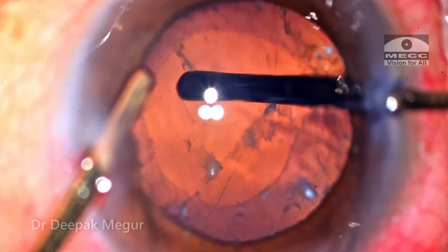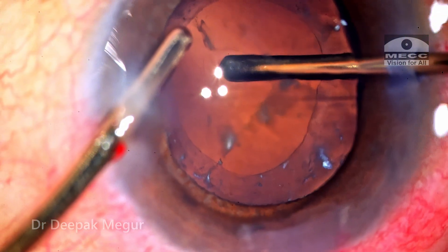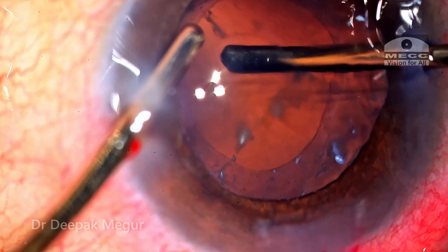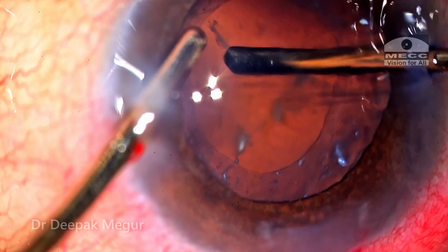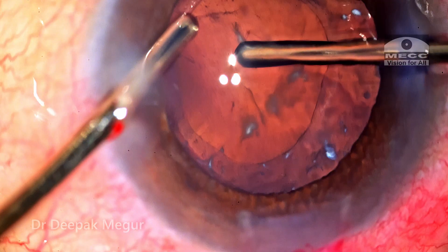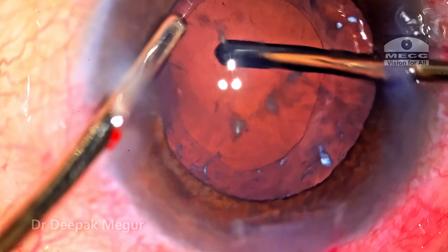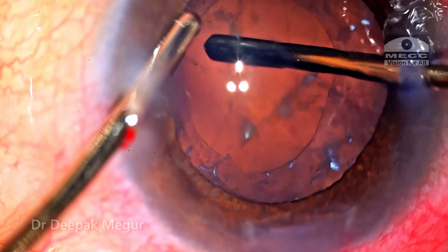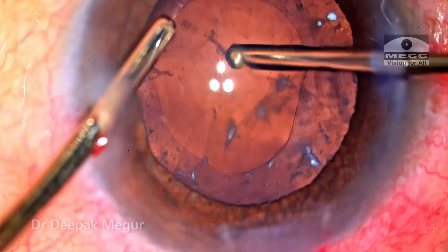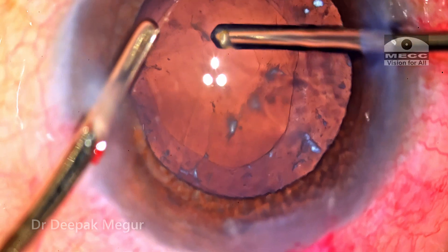The IA cut mode — irrigation, aspiration, cut — was used only to engage the capsule and perform the posterior capsule rhexis. The vitrector is held steady centrally to clear off all the surrounding vitreous along with the lens material. The vitrector is then brought a little bit anteriorly, above the level of the posterior capsule rhexis, to look out for any vitreous fibers that have prolapsed anteriorly. I'm reasonably satisfied with the removal of the lens matter in the Berger's space.